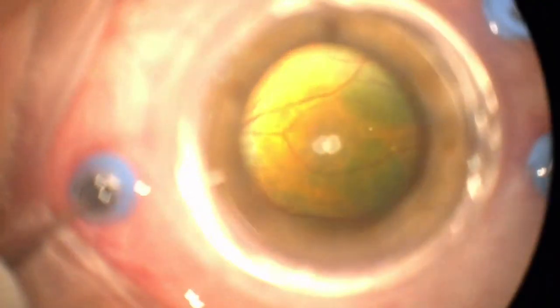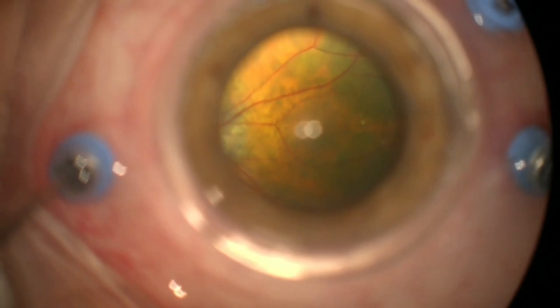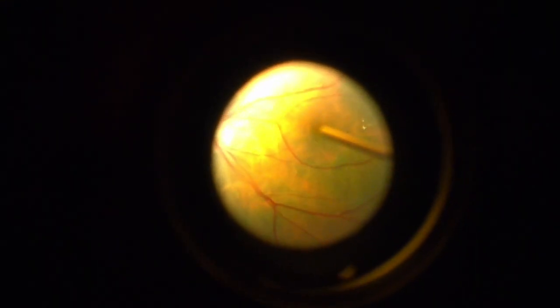Then what I'll typically do is use, sure, we'll show them the loop forceps too. Let's do that now, might as well. This is a device I do not use really ever, but I'm going to try and show it to you. So I will not claim to be the expert with this device. It's called a loop scraper, and you can see how it retracts.